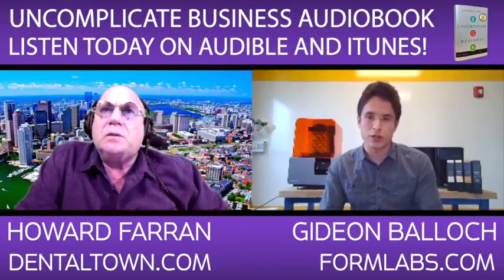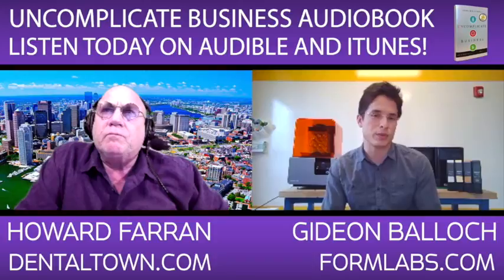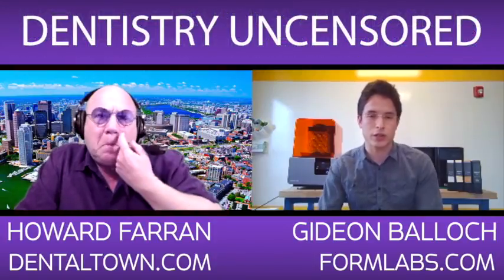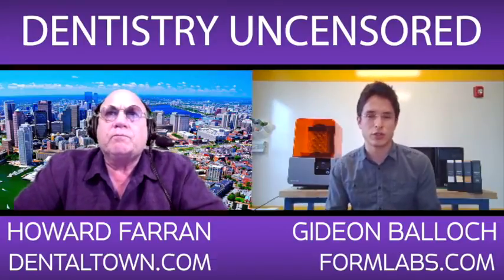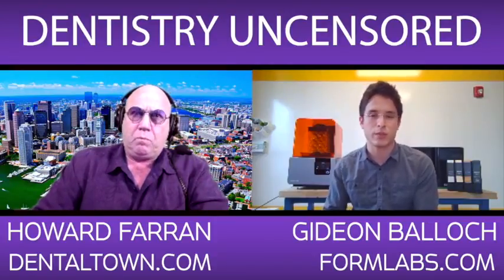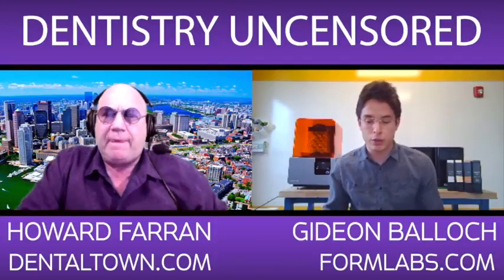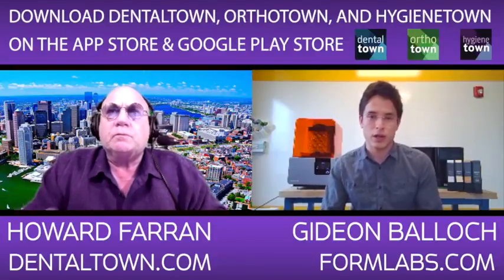Yeah, so I think there's some material limitations there in terms of long term properties, and then there's some aesthetic concerns as well. The technology that's gone into CNC milling materials to give them nice translucencies, to give them multiple shades. That's all really really good and exciting, and it's going to take a bit of time for 3D printing to catch up to that.